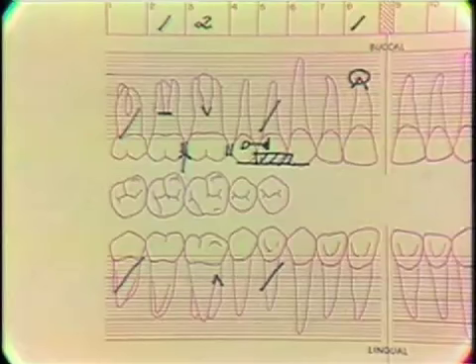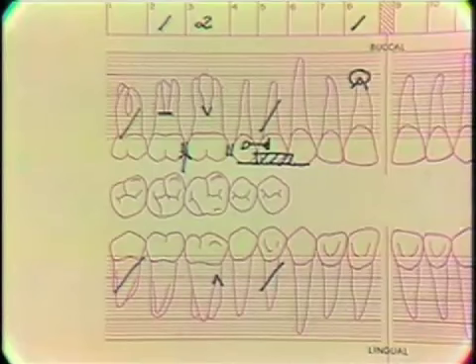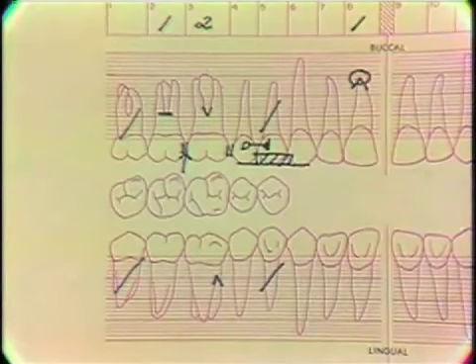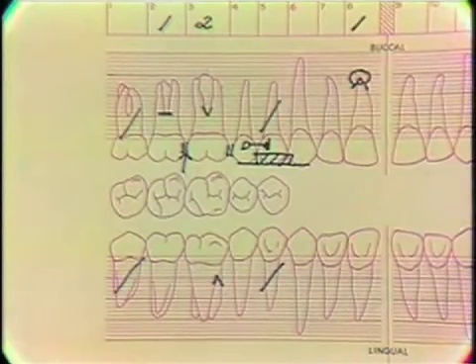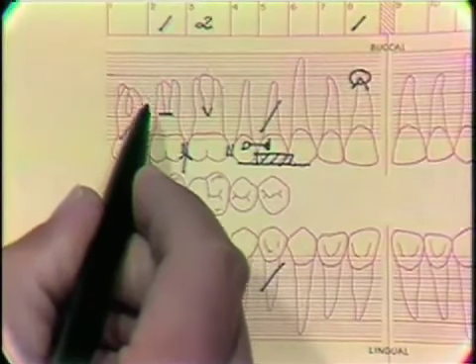Recording the symbols for charting, I would then begin by recording the pocket depth in excess of 3 millimeters. And if you were calling these out to an assistant, we would begin on the distal buccal of the last tooth, which is number 2. And we begin like this.